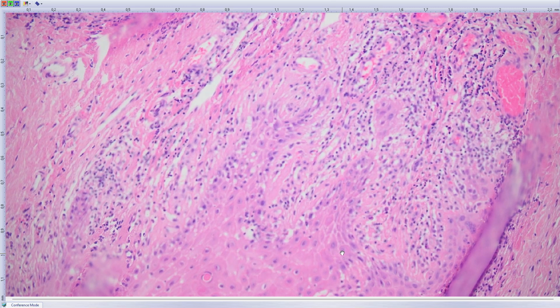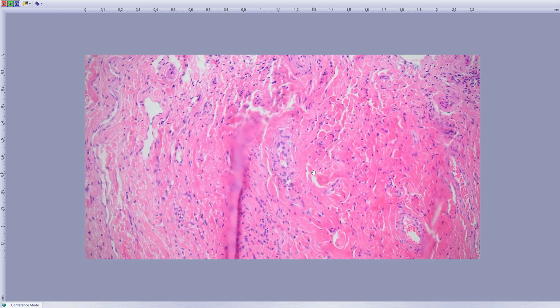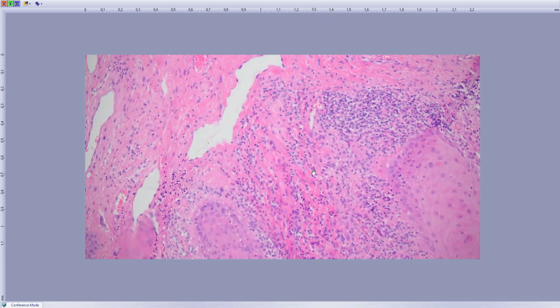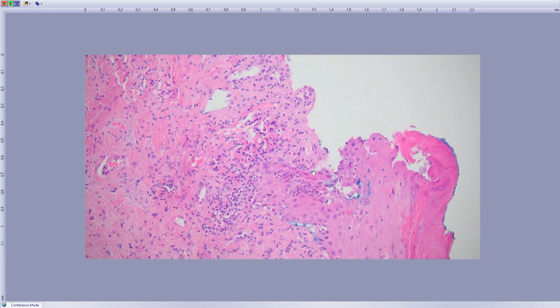It is a very close analog of differentiated type of dysplasia of vulva, with incipient microinvasion, but what is disquieting in this case is that the dysplasia gets even to the peripheral part of it, so that it should be re-excised.